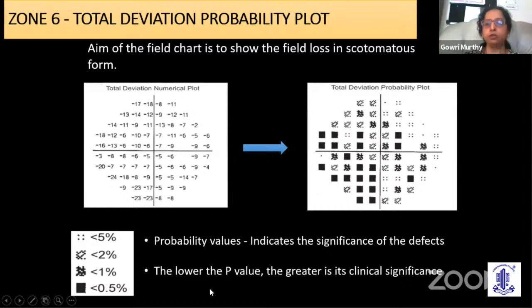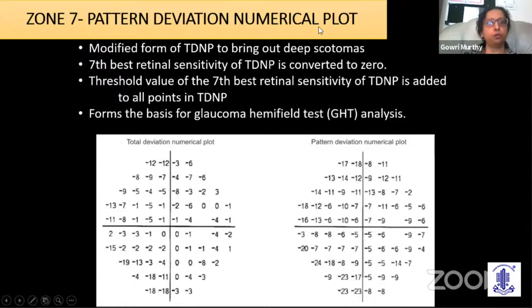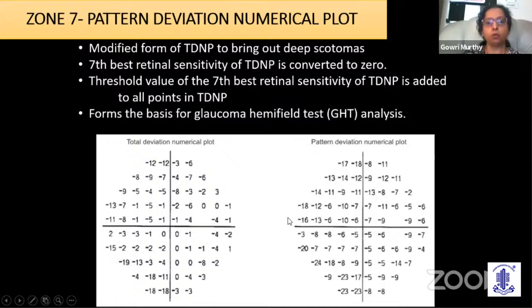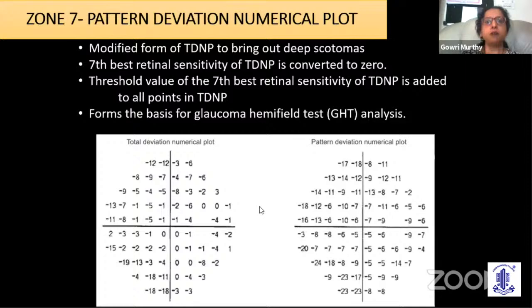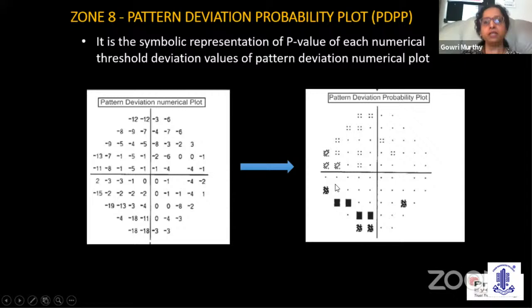The pattern deviation numerical plot removes generalized loss: the seventh best retinal sensitivity is converted to zero and added to all points in the total deviation numerical plot. This pattern deviation numerical plot forms the basis for the GHT test. In the pattern deviation probability plot, symbols tell us how likely each area of the visual field is abnormal, showing localized depression after removing the generalized loss component.